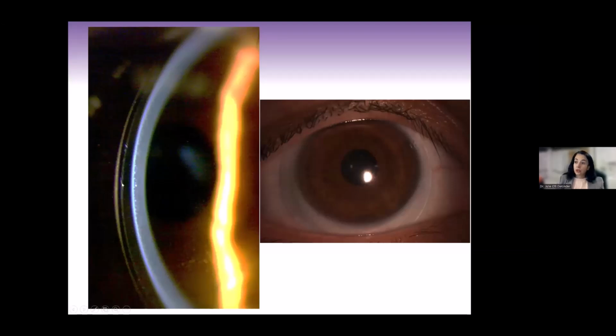But then when you look at your cross section here, you can see the lens is sitting inferiorly. But when you look to see the clearance, you could almost even reduce the clearance another 100 microns, maybe 200, if you like to fit very, very close, where you could take that 34 SAG down to a 31 or a 32. And that's the reason I don't use the OCT.